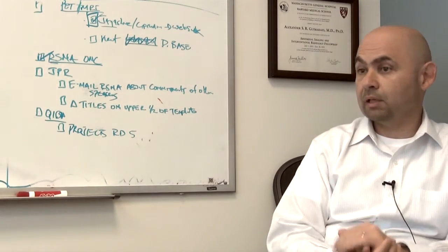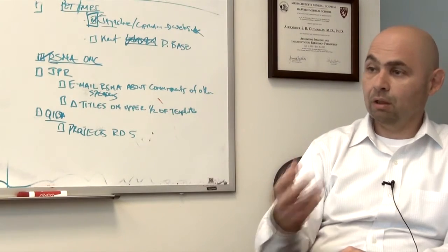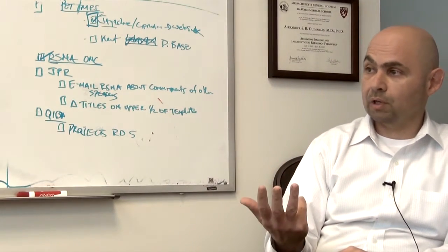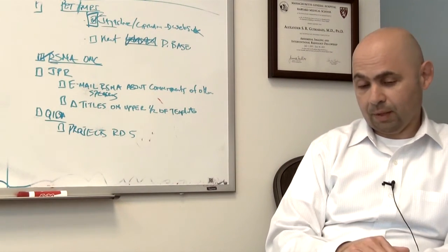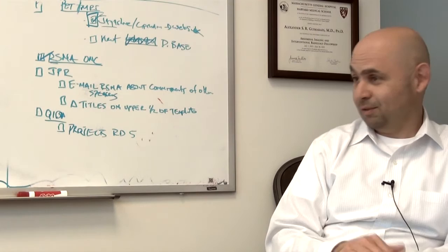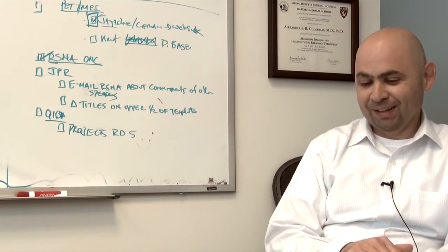and I get one peak only because it's water. If I did ethanol, for instance, which is CH3CH2OH, there are 3 different classes of protons, I would get 3 peaks for ethanol. I choose ethanol because it's a university, and I would imagine that the university students are familiar with ethanol.